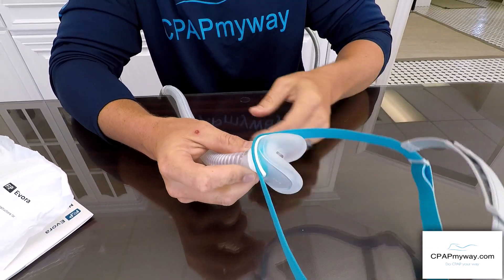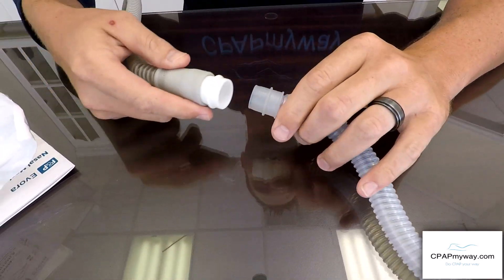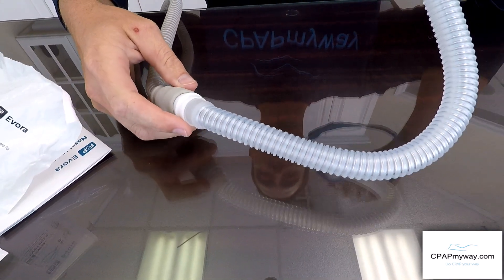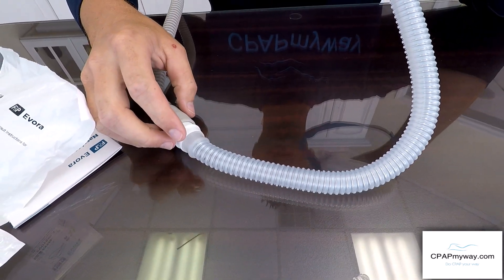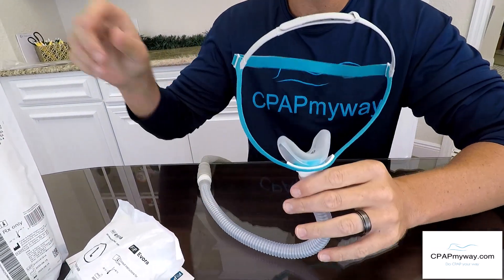Additionally, like most masks, you get a quick connect in the back which allows you to get up in the middle of the night, disconnect and go to the restroom, then come back and reconnect for a quick start back on therapy.